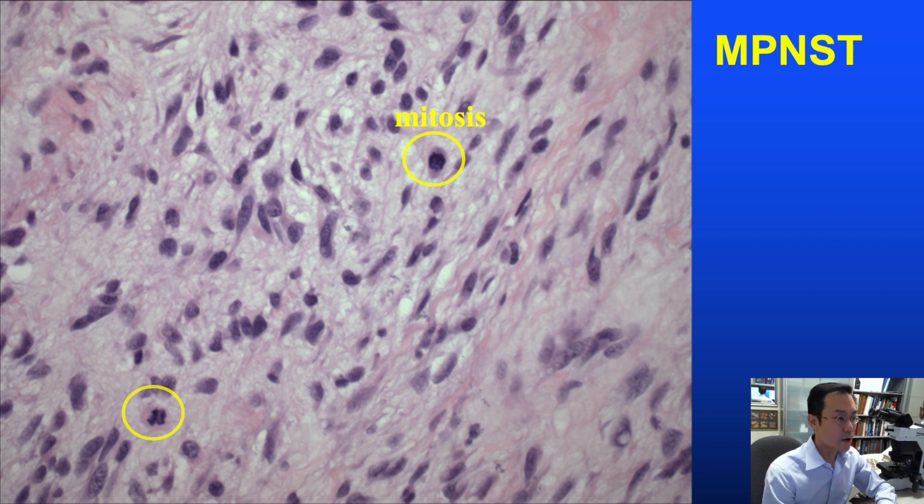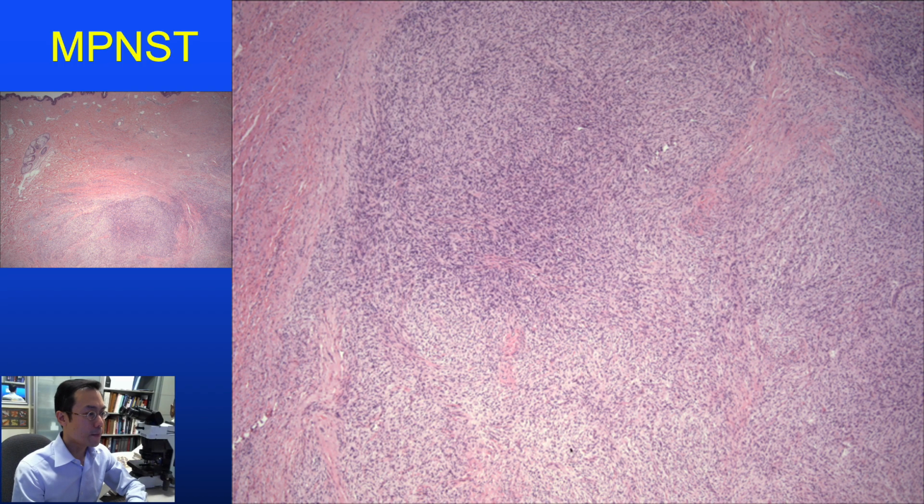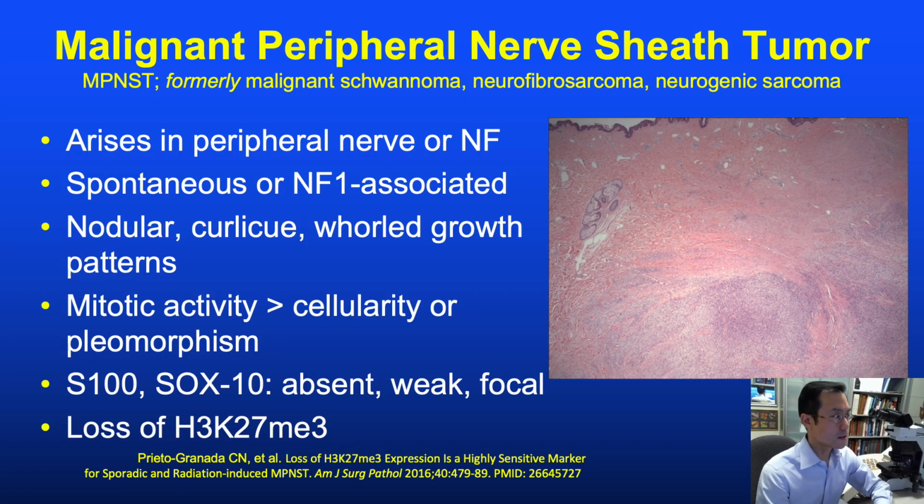The malignant counterpart of neurofibroma, malignant peripheral nerve sheath tumor, MPNST, disproportionately affects patients with NF1. We expect to see atypia and increased mitotic activity. As a rule, MPNST does not arise primarily within the skin, but more likely from underlying soft tissue. The main differential diagnosis for MPNST in dermatopathology is spindle cell or desmoplastic melanoma. So we can use the fact that at least half of MPNSTs will arise in patients with a history of NF1 to kind of guide our prior probability.